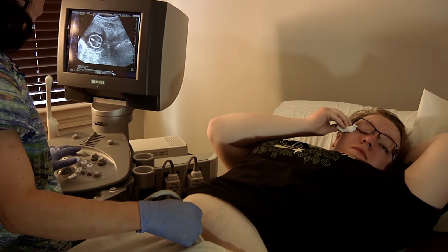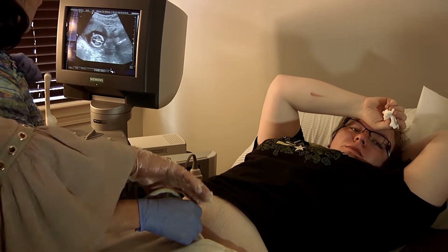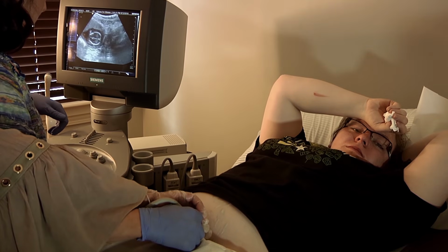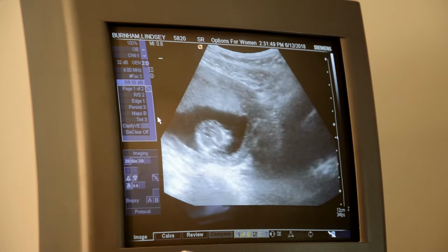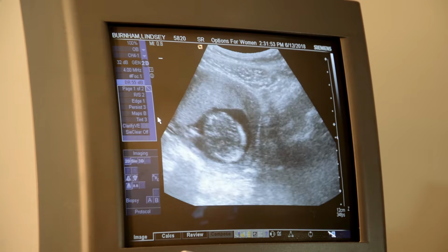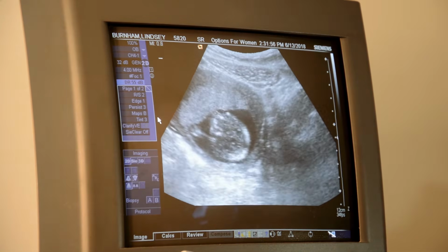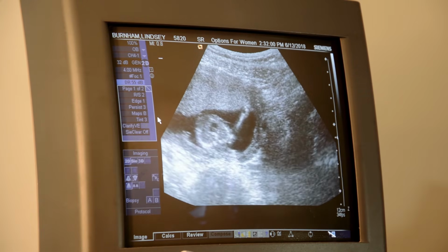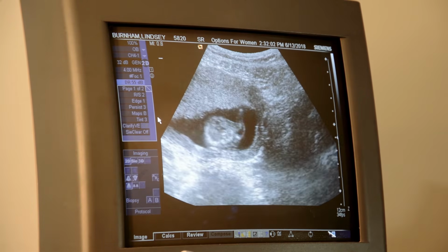Good. Now, do you want me to show? Oh, sorry. Just stay there a minute. I want to show you something, just for teaching purposes. Okay, so let's find the head. Okay, and then go down to the heart. Heart, okay. And you want to get the heart?